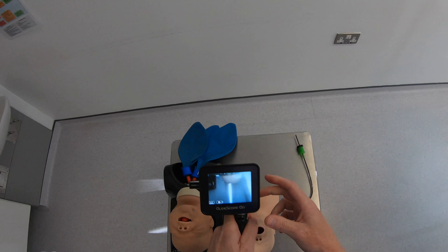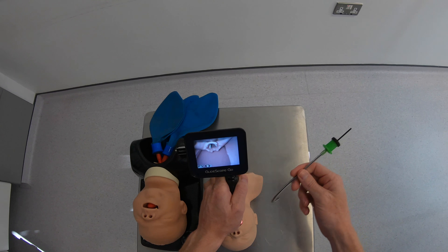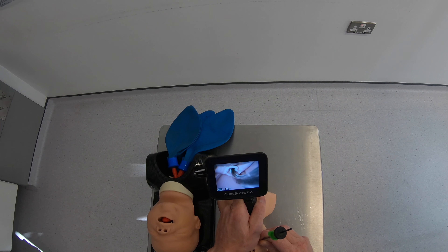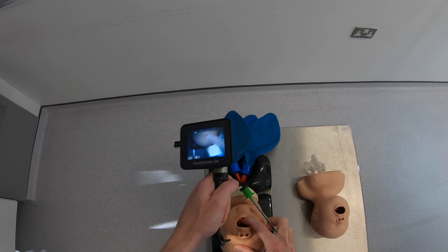Let's have a look and see how it performs to do an intubation. I've got a normal airway here in a neonatal mannequin. Nice view — endotracheal tube coming in and no problems doing the intubation.